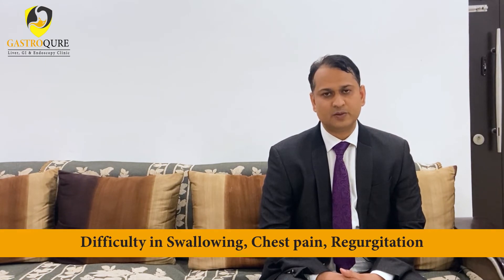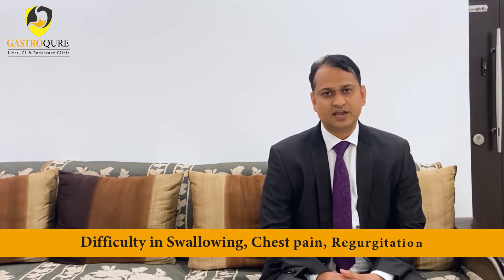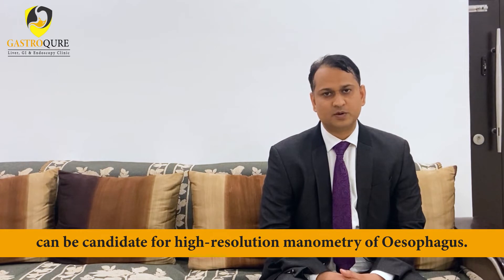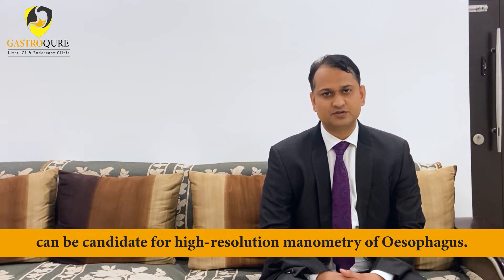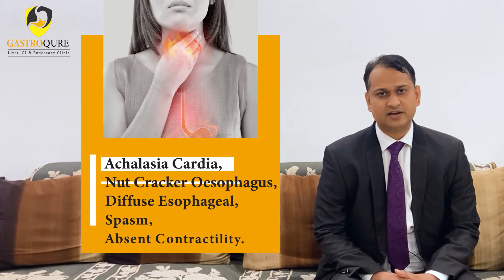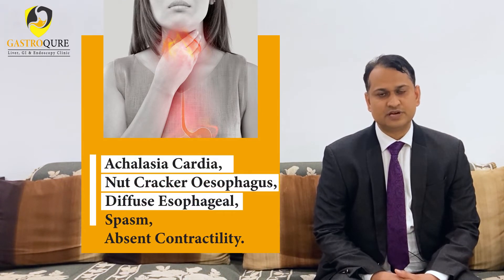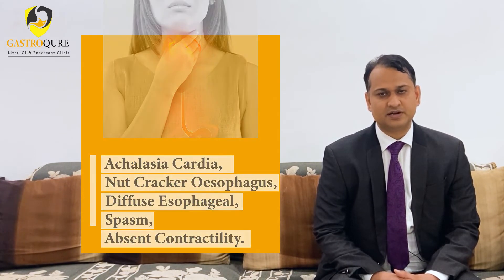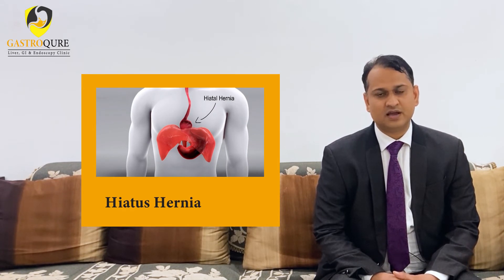Patients who are suffering from difficulty in swallowing, chest pain, or regurgitation can be evaluated with high resolution manometry to identify various motility disorders of the esophagus, such as achalasia cardia, nutcracker esophagus, diffuse esophageal spasm, and absent contractility. This test also measures the size of hiatal hernia.